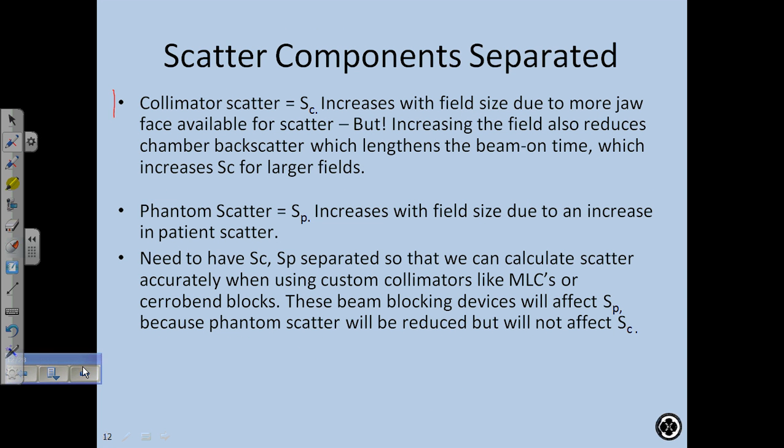Okay, so that was that. I just discussed that. Does all that make sense, what I said? Okay, so I discussed that point. And then phantom scatter, S of P, increases with field size due to an increase in patient scatter. So this only has to do with what's happening inside the patient.